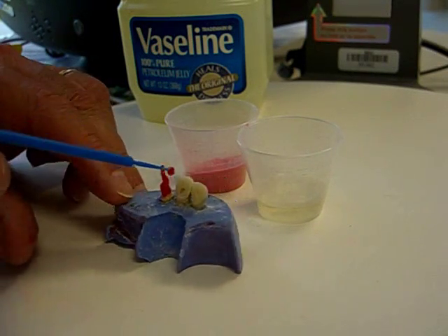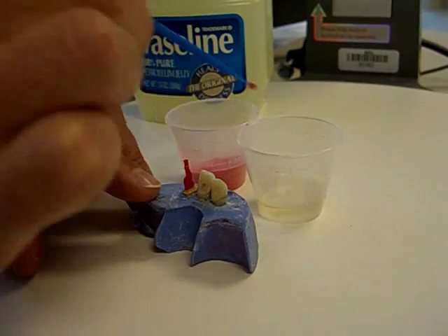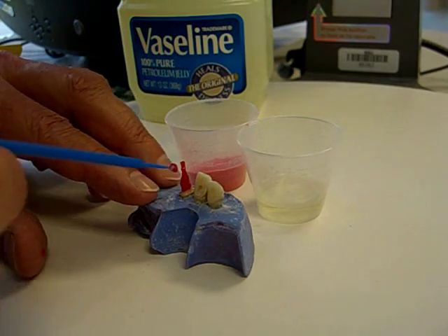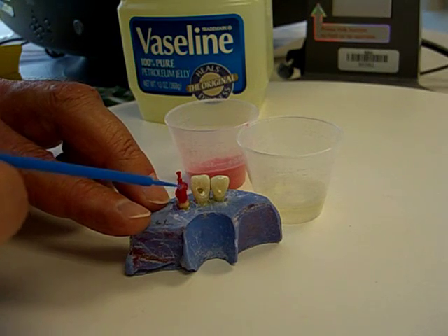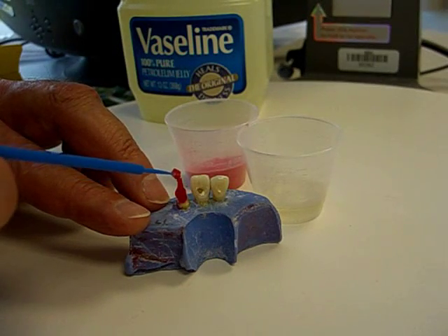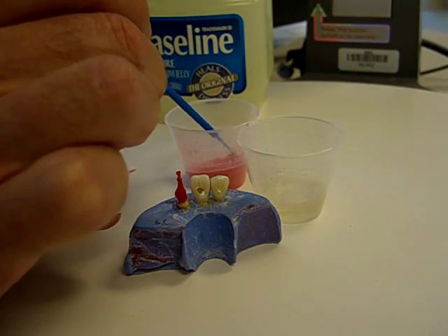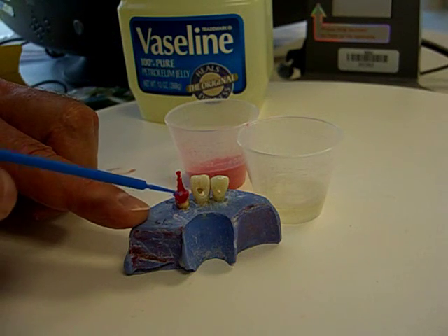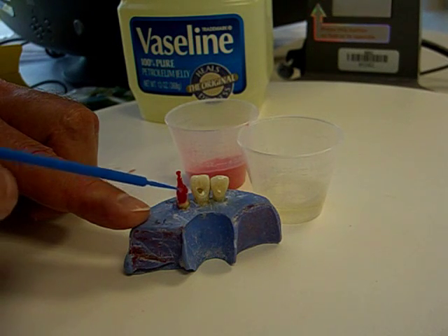I'm continuing to build up. Now remember, ultimately there's only so much that you can do using this brush. The shape ultimately required — that of an ideal tooth preparation — will have to be accomplished with a high-speed handpiece and a diamond bur. So all I'm doing right now is trying to get a basic shape going.